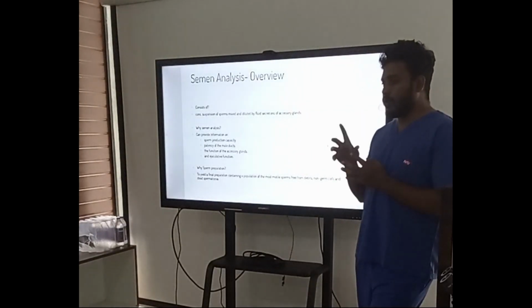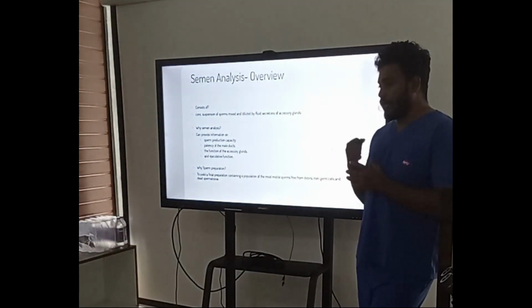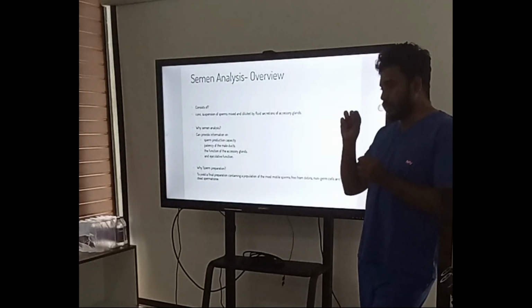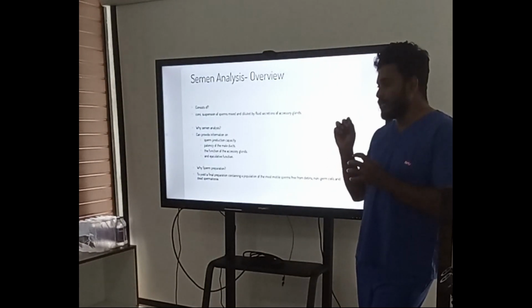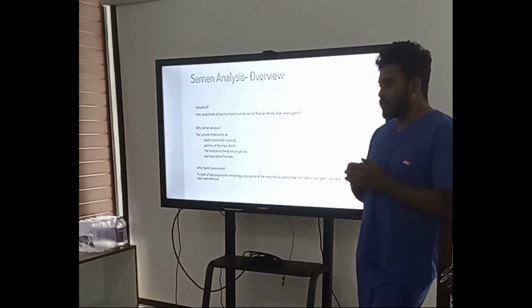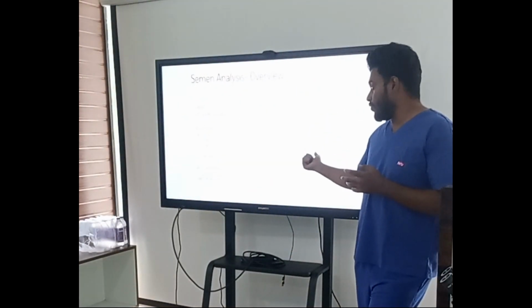We have something called 80% and 40% gradients that denote the density of the gradient. The 80% will be denser, and the size of the balls will be smaller, so the pore size will also be smaller. The 40% gradient will have beads, that is, when you observe it in a microscope, it will look like a bead only. So you will have the 40% layer above the 80% layer that we will be looking at.